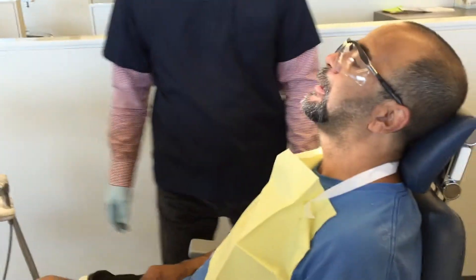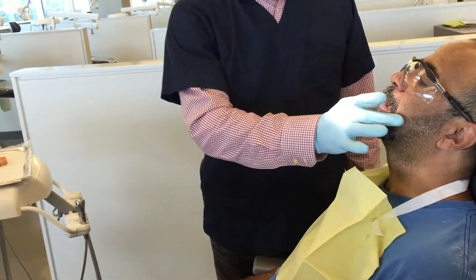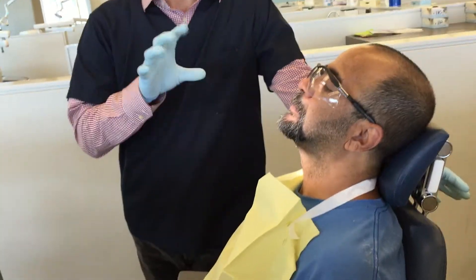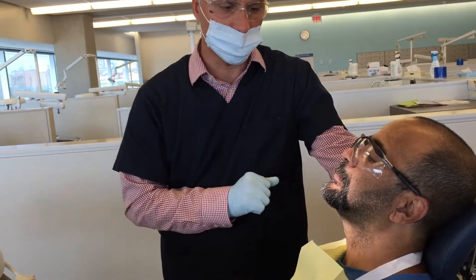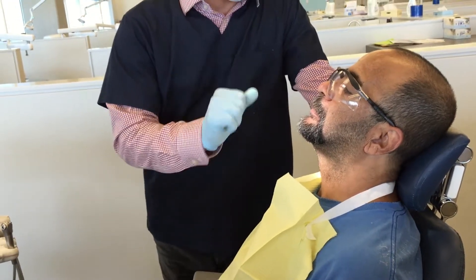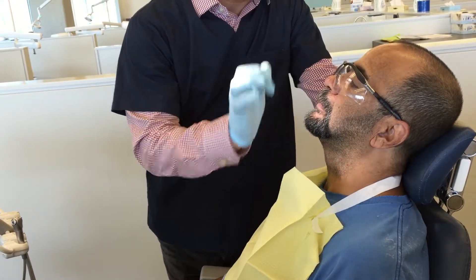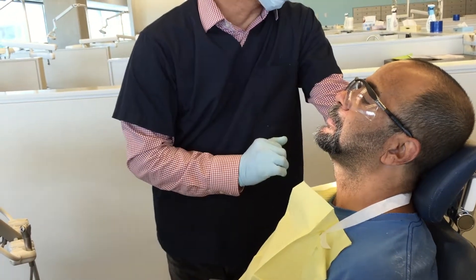The next step is to establish the VDR and VDO. Before I move to the lower bite block, I'm going to establish Robert's natural resting position as well as his natural chewing position — the vertical opening — which is the VDR and VDO. Because Robert has a beard, we're going to put a little bit of tape here, as it's very difficult to make a marking in the beard. I can make a marking on the tip of his nose and put a little tape on the bottom to establish that vertical.